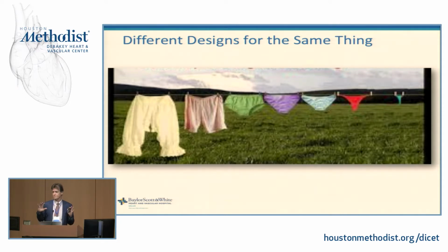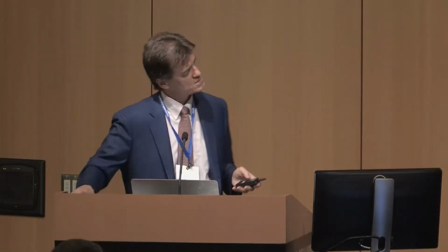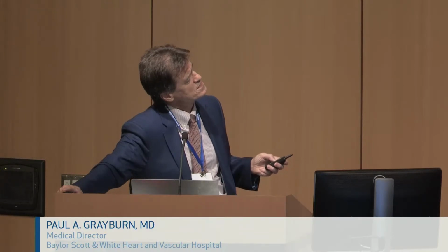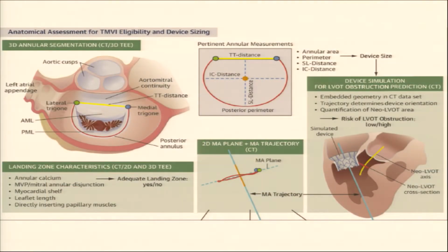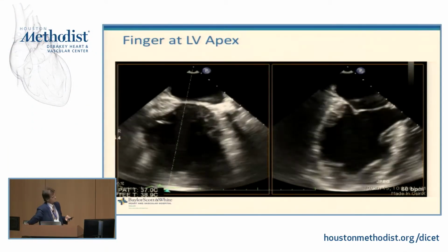And the thing that we know from the stent world is over time, the engineers make these things better. They'll always get smaller and better over time. But they're not there yet. Right now, those valves are huge. And the problem with them is we do these CT scans, and we look at the trigones, which you can see very well on CT. You can't really see them on echo. We can measure the intertrigonal distance, the intercommissural distance. We can do all these measurements, but we're really looking to put a simulated device in and see, is there room in the LVOT, or are we going to occlude the LVOT with the device? And a lot of times we find that we can't put these devices in. So, in our experience with the Intrepid device, for every patient we put in, they turned down 7 because the device wouldn't fit. So right now, these devices are cool, interesting, but they have technical problems.